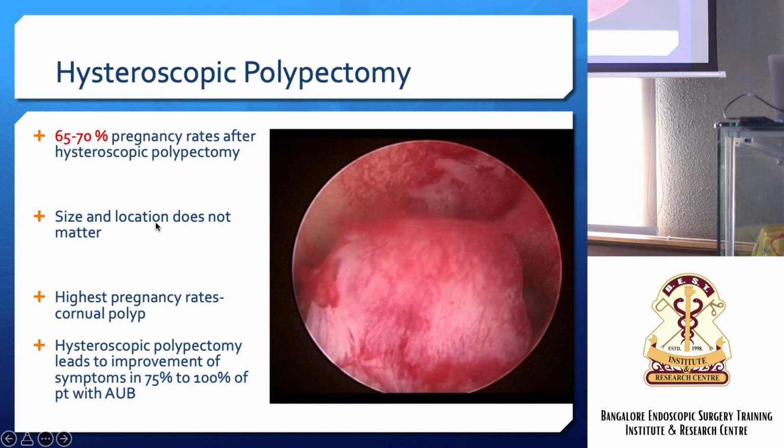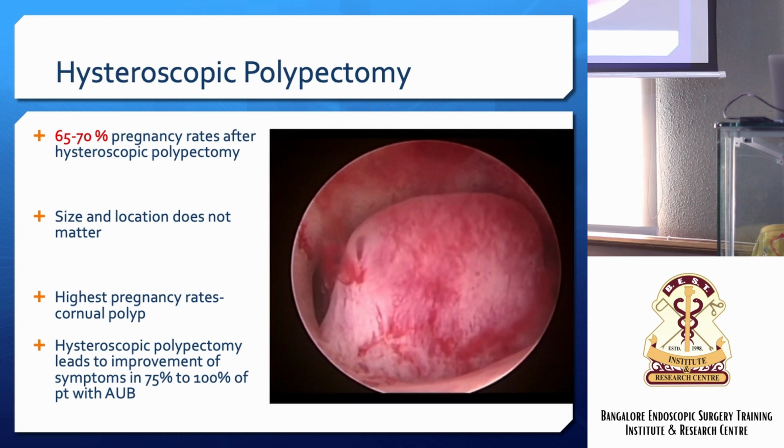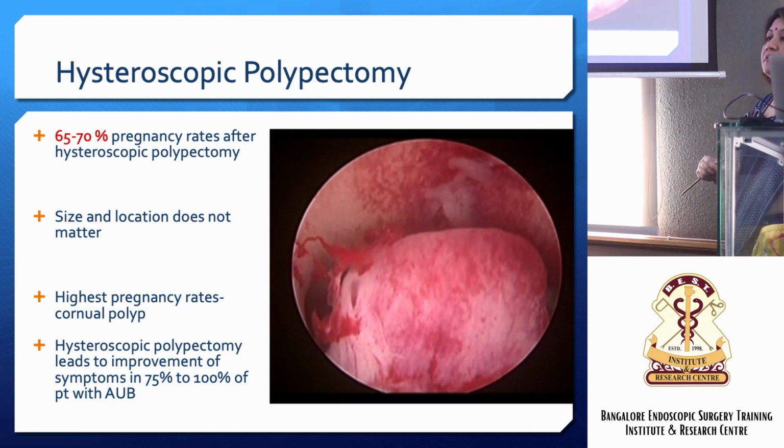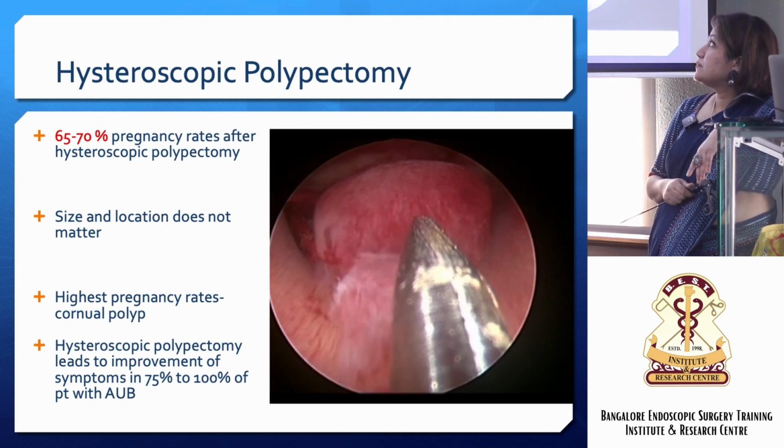Okay, now this is one of the most satisfying surgeries to do. This is a very old video of mine. I think I should start putting up newer videos. But anyway, this is one of the most satisfying surgeries to do, because the results are good, whether it's for infertility or for intermenstrual bleeding.